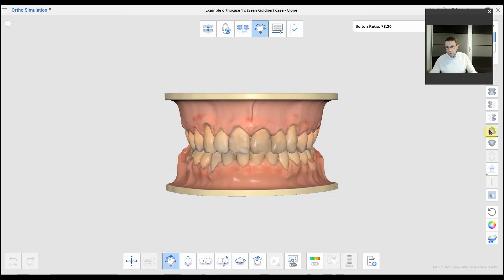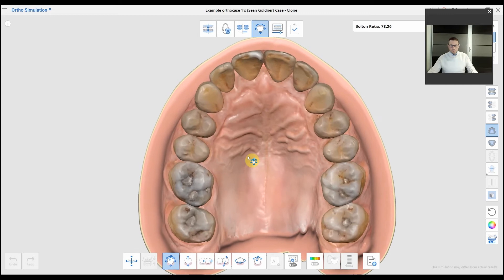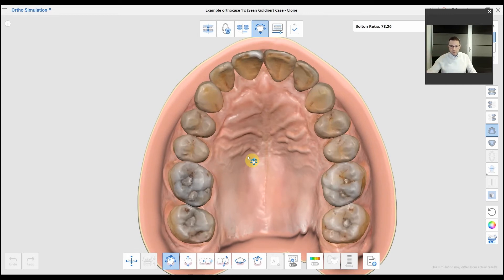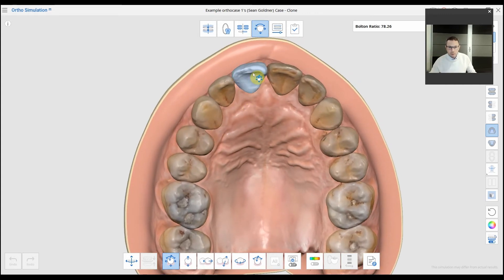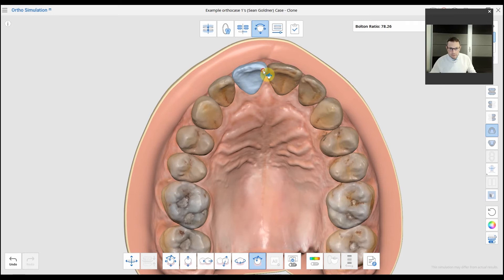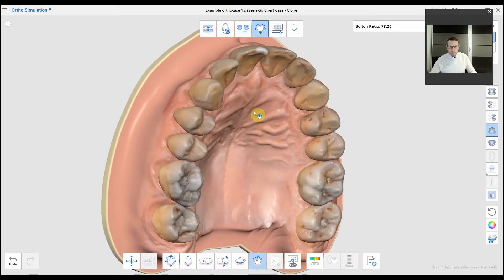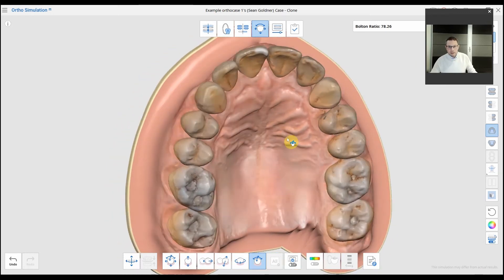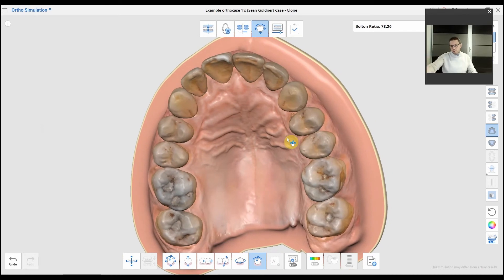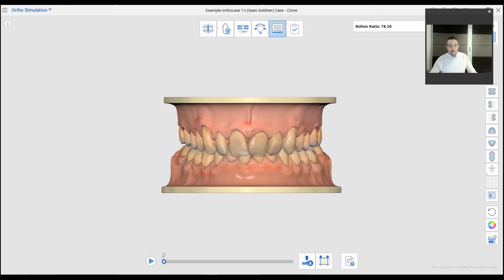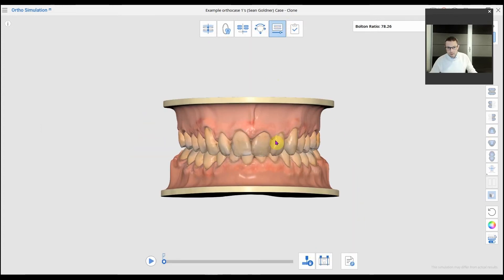It takes some elements of an orthodontic treatment planning package. Because all of the teeth are segmented as separate 3D models, you can take each tooth and move it around using controls at the bottom — for example, changing the tilt of a tooth. It's a great way of educating patients about what's possible with clear aligners or fixed orthodontics, and you can show a video as well.